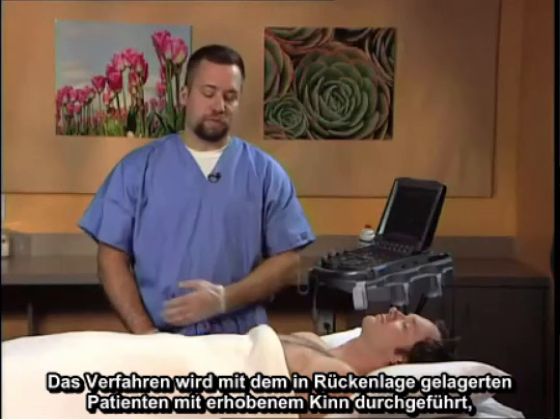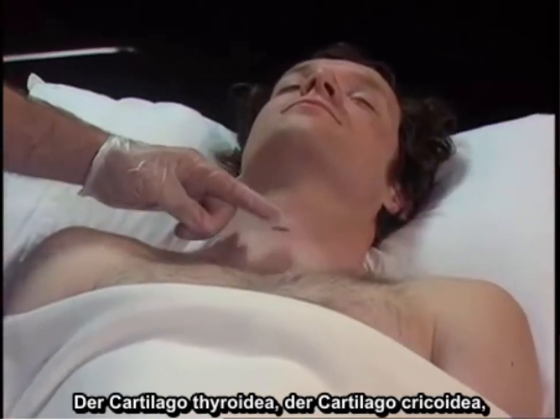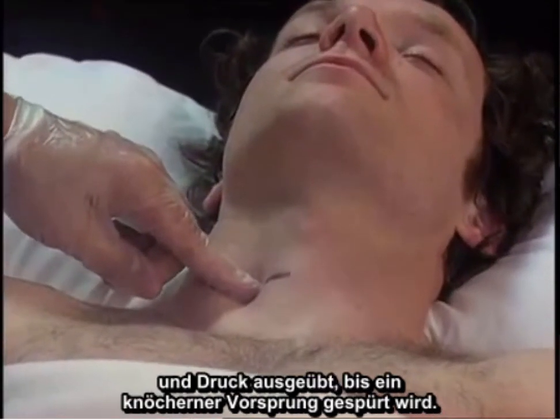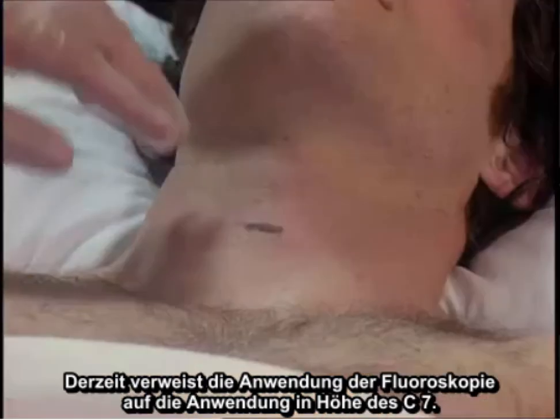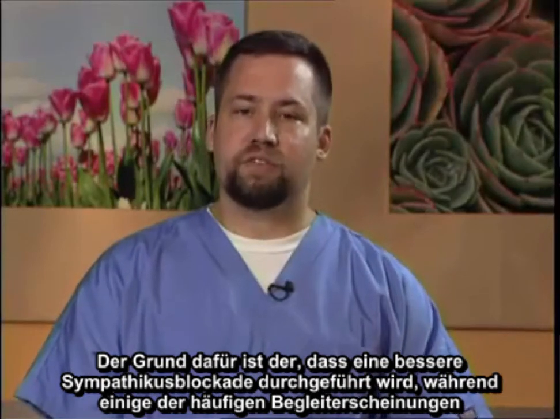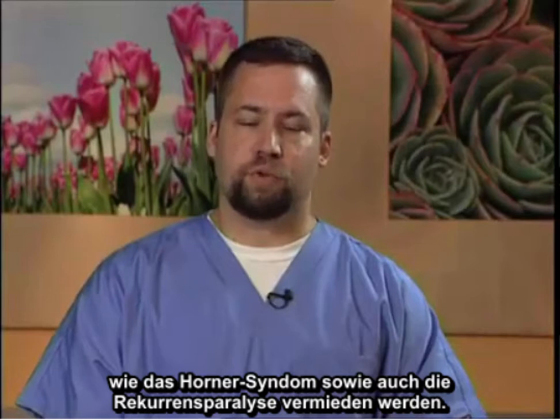The procedure is performed with the patient in the supine position with the chin up. The following anatomic structures are identified: the thyroid cartilage, the cricoid cartilage, and then the finger is placed in the groove next to the trachea with pressure applied until a bony protuberance is felt — this is Chasniak's tubercle or the transverse process of C6. Currently, the use of fluoroscopy indicates use at the C7 level to provide better sympathetic blockade while avoiding common side effects such as Horner's syndrome and recurrent laryngeal nerve paralysis.